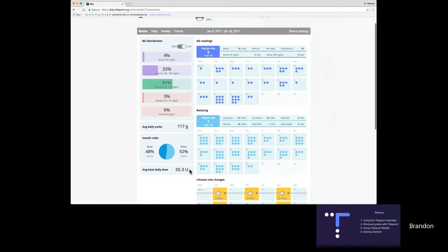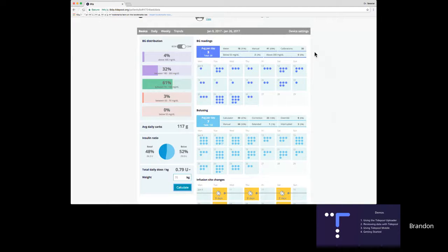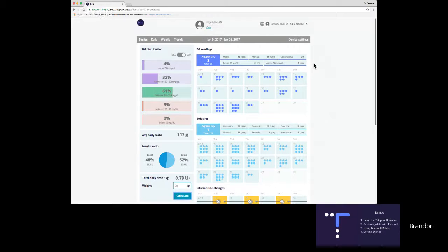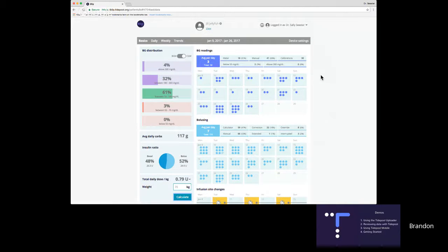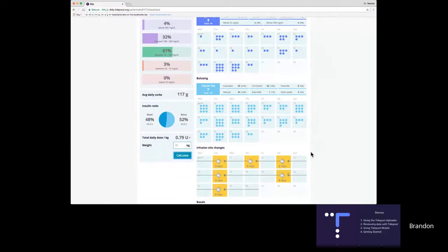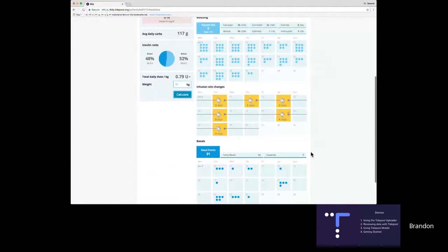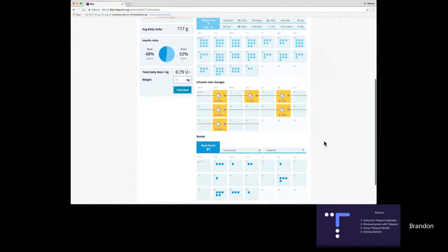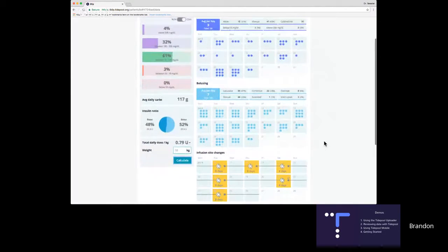If you're a doctor who likes to see daily dose per kilogram, you can type in Jill's weight and click Calculate, and we show you the total daily dose per kilogram. On the right side of the screen, we get a quick view of how often Jill is checking her blood sugar readings, how often she's bolusing, how often she's changing her infusion sites, and a glimpse of how often she's using the temp-basal or suspend features on her pump.